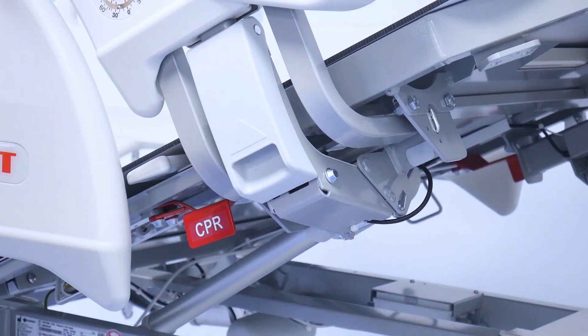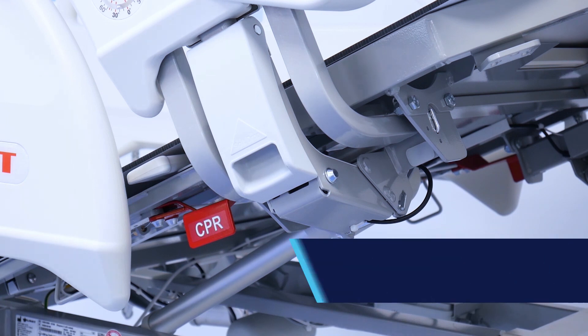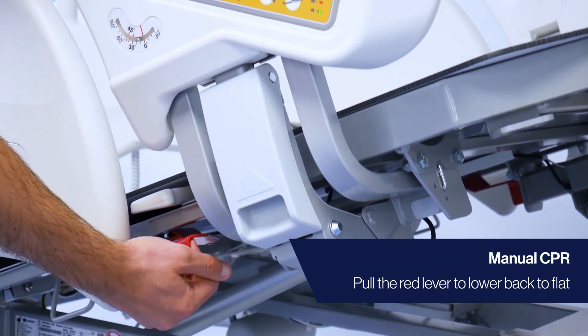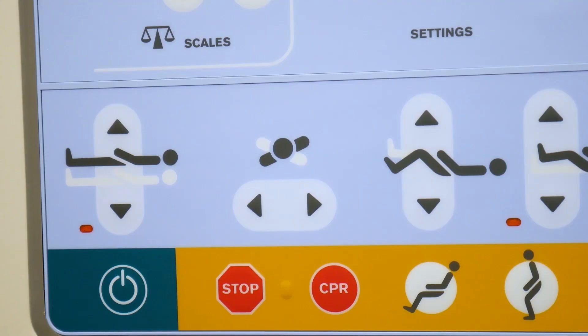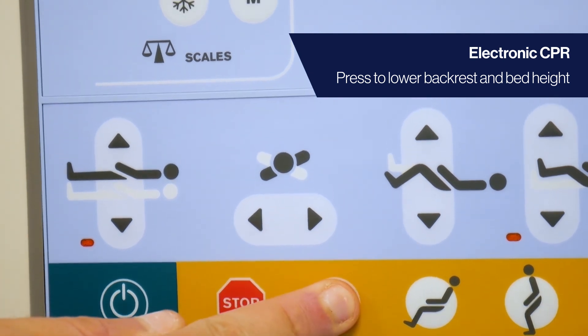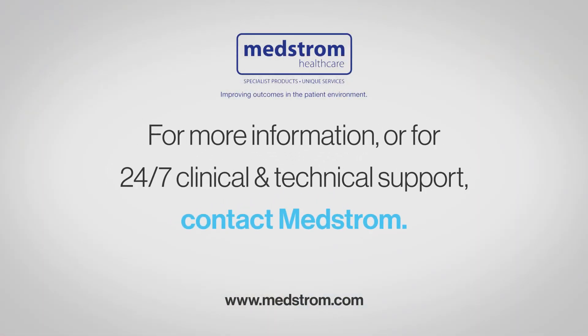CPR is available both manually and electronically. Manual CPR is located on both sides in the centre of the bed — pull and hold the red CPR lever to lower the backrest to a flat position. Electronic CPR is available via the iBoard; press the CPR button to lower the backrest and the bed height simultaneously. For more information or for 24/7 clinical and technical support, contact MedStrom.